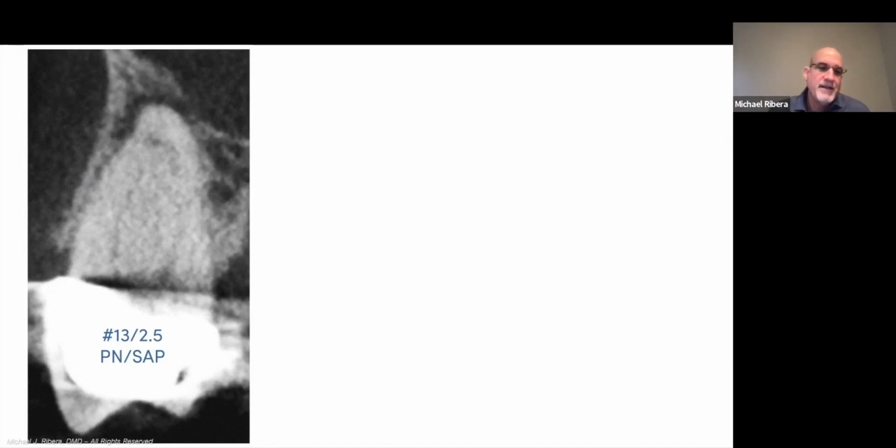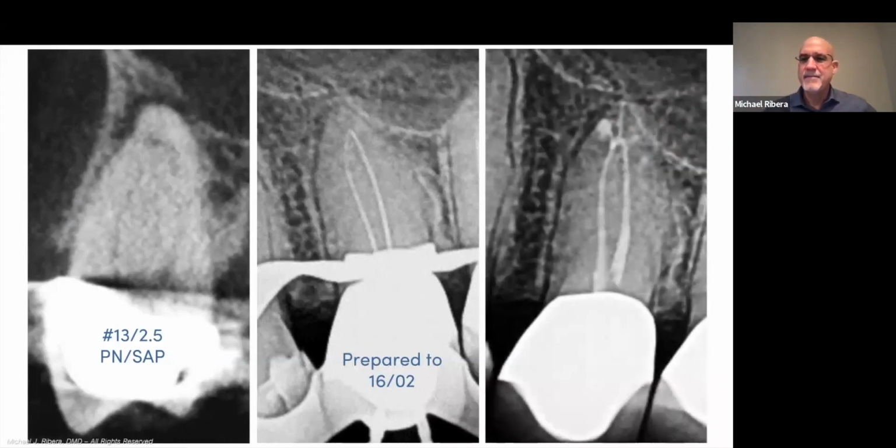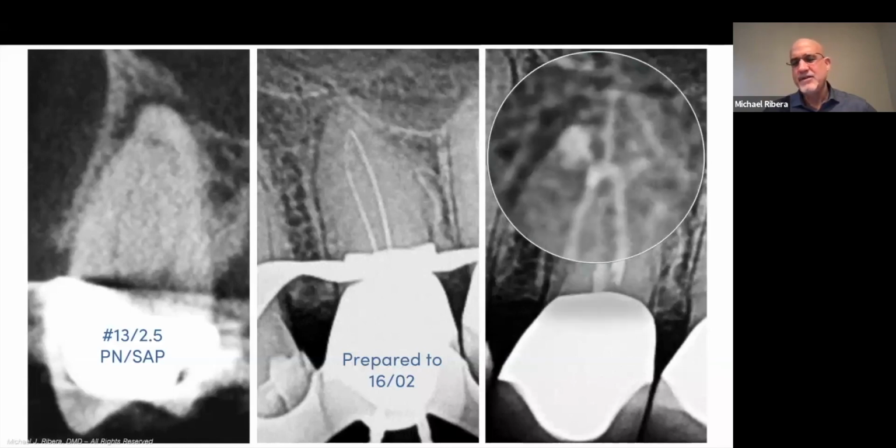This is an upper bicuspid. Two working length files that seem to meet about 1 millimeter short of the radiographic terminus. So we're not going anywhere beyond about 1 millimeter. These are really tight, so I secured or owned my glide path with a 1602 instrument, and that's it. I built a platform, ran GentleWave, and that's the pack. Look at this at magnification, and here you can see a trifidity that was uncovered after running GentleWave. The terminus was never once recapitulated. I never maintained patency because GentleWave physics does the work for you.